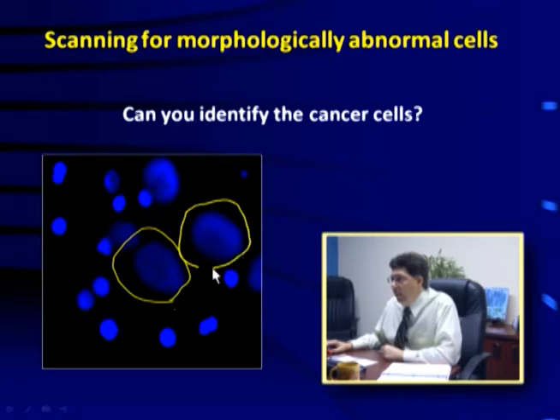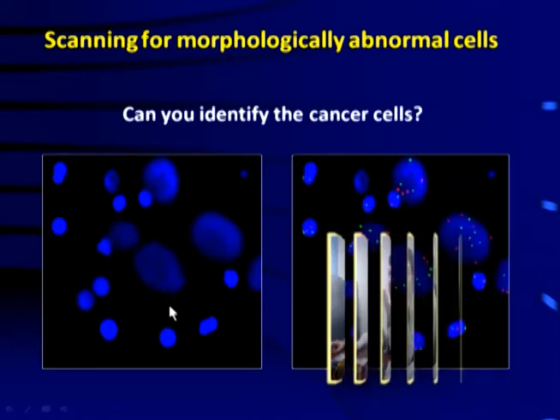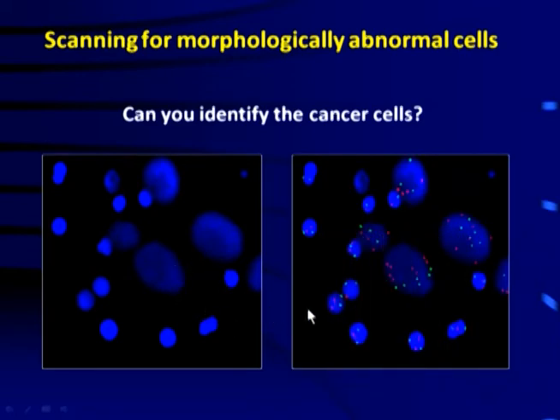And so, although it's very rare that you will see all 4 abnormal cells, or a minimum of 4, which is required, in one photograph, you may on occasion, and here's one of them. As an example, once the technologist, or in this case the instrument, locks on to these, we then add single band filters. And in this photograph, we only took a picture of a red and a green filter. So you'll see no aqua and no gold signals, because the point I was trying to make was that here are your abnormals. They're very easy to identify based on their morphologic characteristics under the microscope.